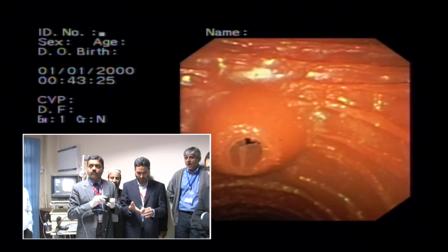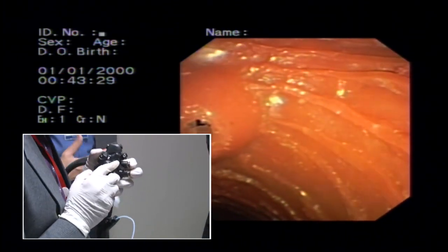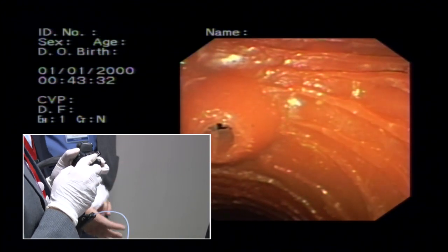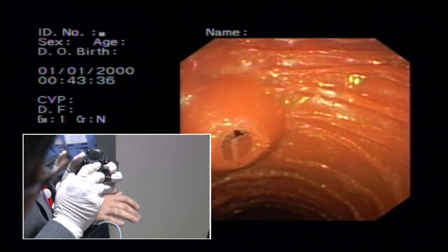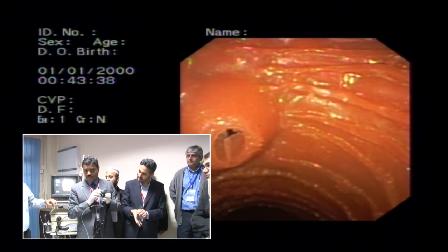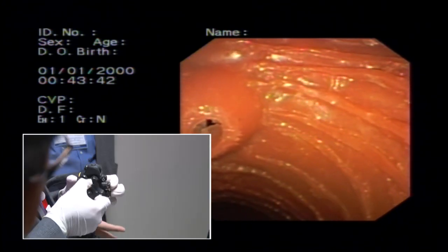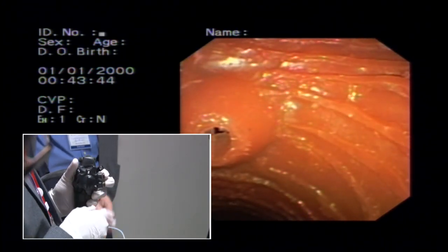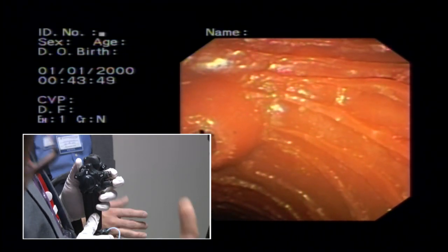और दूसरा वही बात है कि आपके ERCP में मूवमेंट हमेशा जो होंगे ना, they are going to be fine and deliberate. ऐसे रैपिड मूवमेंट नहीं होंगे, क्योंकि रैपिड जो करते हैं तो they never work. So in order to make the direction upwards, you haven't mentioned the use of elevators at all. Upward what? The cannula? The cannula when you are trying to cannulate? Yeah, cannulates and going upward.